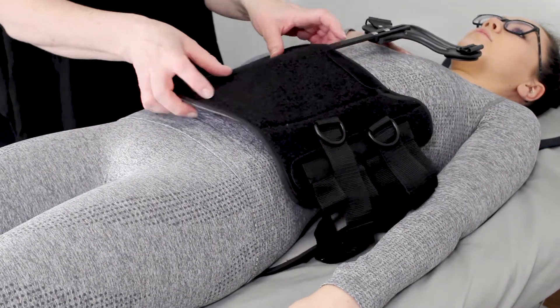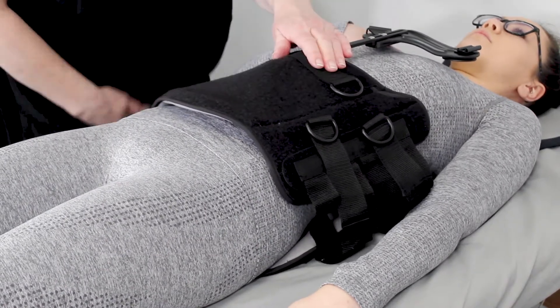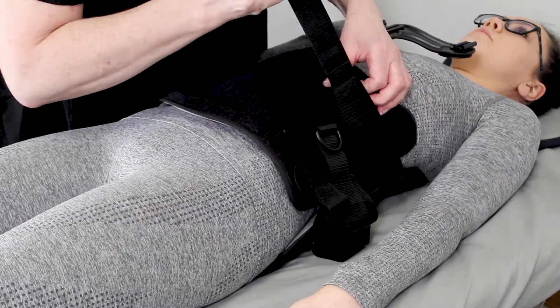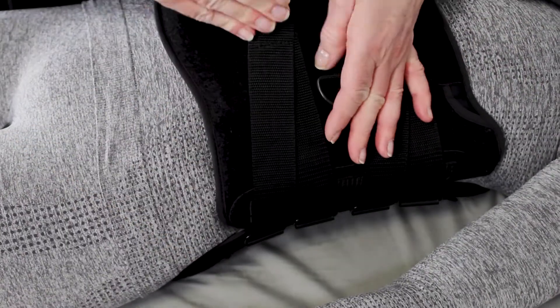Ensure the brace is fitted centrally both posteriorly and anteriorly. Fasten the side straps and ensure the ATE is sitting just below the clavicle. Pull the bivalve section to increase compression to the affected area.